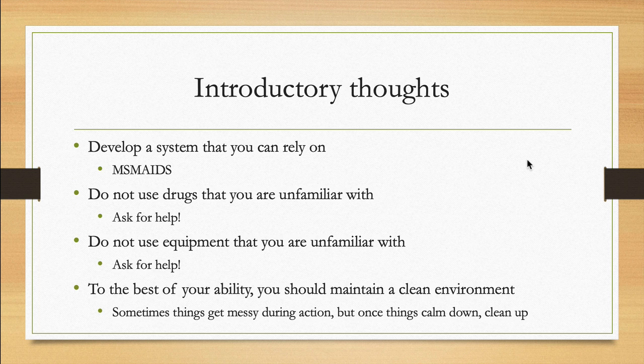All right, a couple of introductory thoughts. It's important to develop a system for setting up a room that you can rely on. The one we're going to go over today is based on a classic acronym called MSMAIDS. I want to put a couple caveats here that are very important to keep in mind as you proceed with your training. The first of which is, do not use drugs that you're unfamiliar with, ask for help, and do not use equipment that you're unfamiliar with, ask for help. Also, to the best of your ability, always maintain a clean work environment.